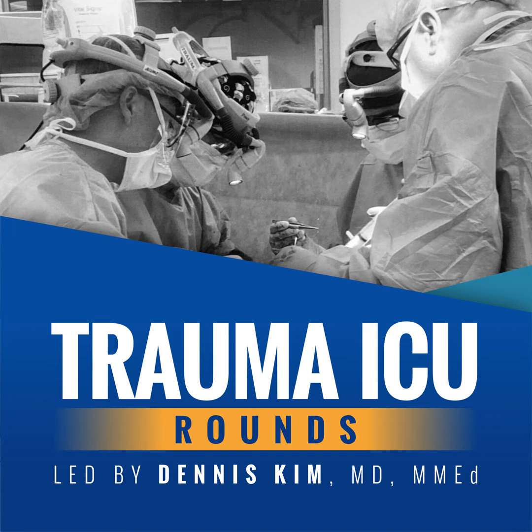Number 1, progressive decreases in the number of ventilator-assisted breaths during intermittent mandatory ventilation. Number 2, progressive decreases in the level of pressure support during pressure support ventilation. Number 3, intermittent trials of spontaneous breathing conducted several times a day via either a T-piece or CPAP. And finally, once daily trial of spontaneous breathing via a T-piece. And weaning was considered successful if extubation was achieved within the 14-day period and reintubation was not required within 48 hours of extubation.